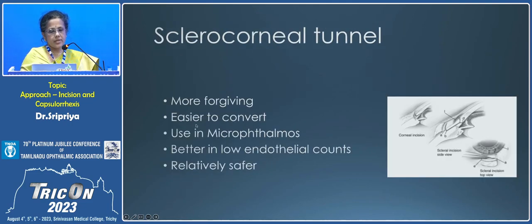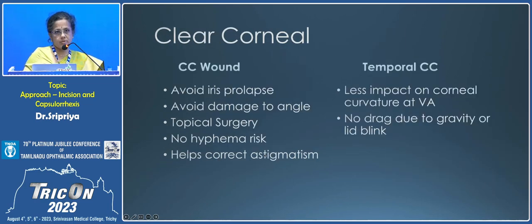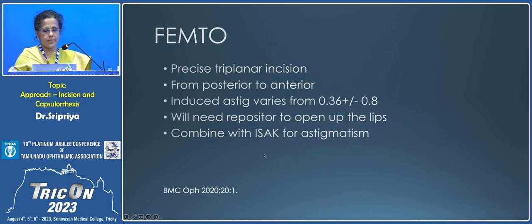The sclerocorneal tunnels are safer, especially in budding surgeons, because you can always extend it later on in case you run into trouble. And it is ideal in microphthalmic eyes and in eyes with low endothelial count. You start about 2 millimeters behind the limbus and then enter just beyond the palisade.